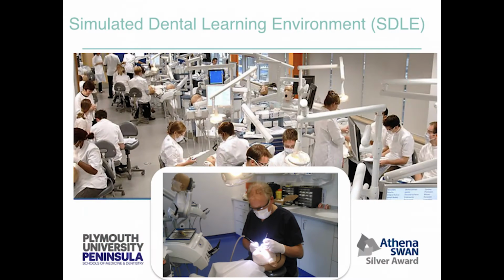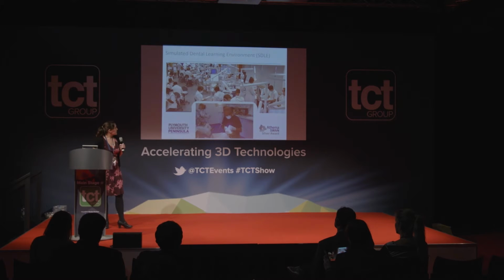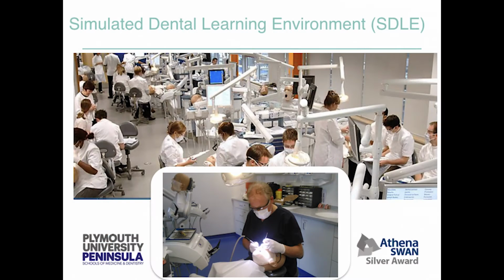So this is our simulated dental learning environment at Plymouth. And hopefully you can see that. As you can see, it's quite a large lab. It's got about 60 simulated dental chairs. And on those chairs, you've got a lamp, a bracket table, drills, suction, foot pedals, everything you'd expect from a dental chair in practice, except instead of having a real patient, you have what's called a phantom head. And the picture at the bottom there is one of our professors just trialing out a new procedure.